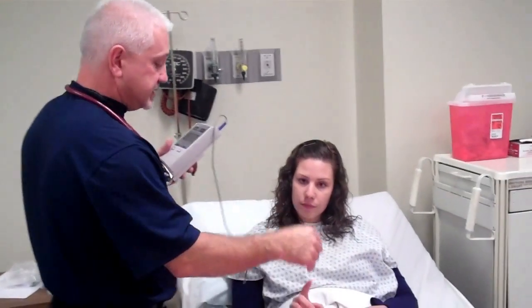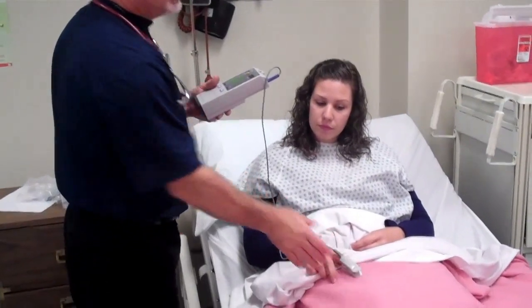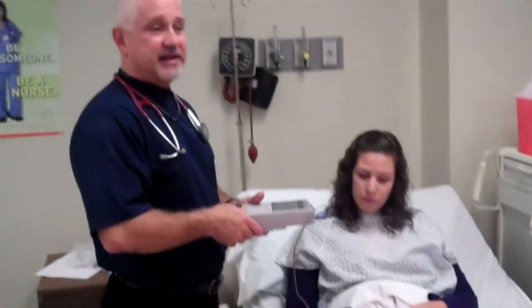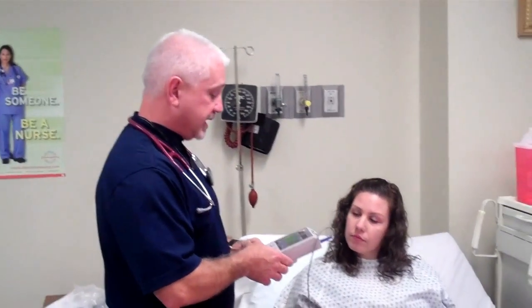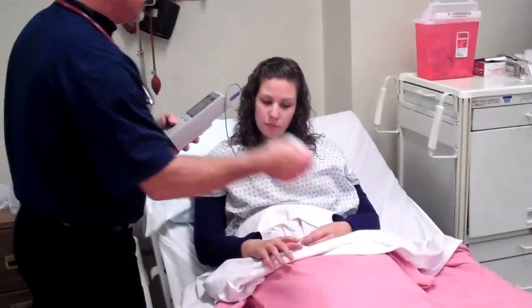The pulse oximeter actually measures the saturation of the hemoglobin molecule. So as long as she's not wearing nail polish on her fingers, and she has good perfusion in her hands, and she hasn't inhaled carbon monoxide, this should be a fairly accurate test. It will not be perfect, but it should be pretty accurate. Okay, I see that her saturation says that it's 88%.